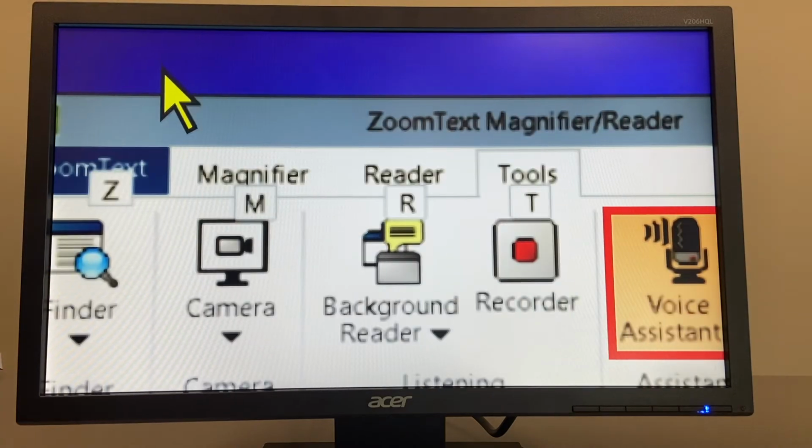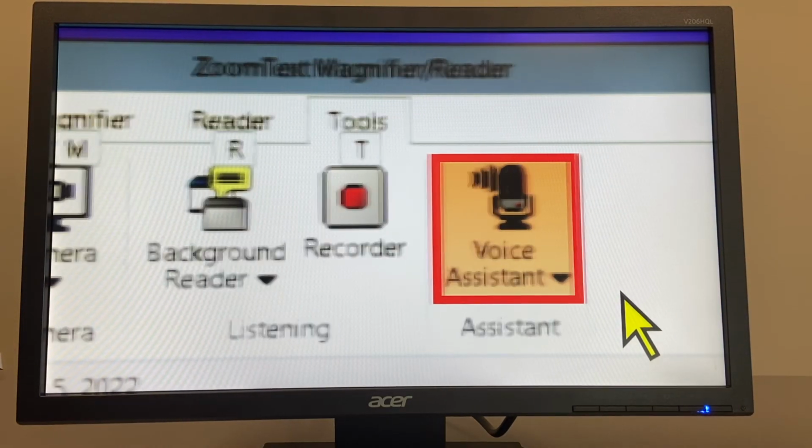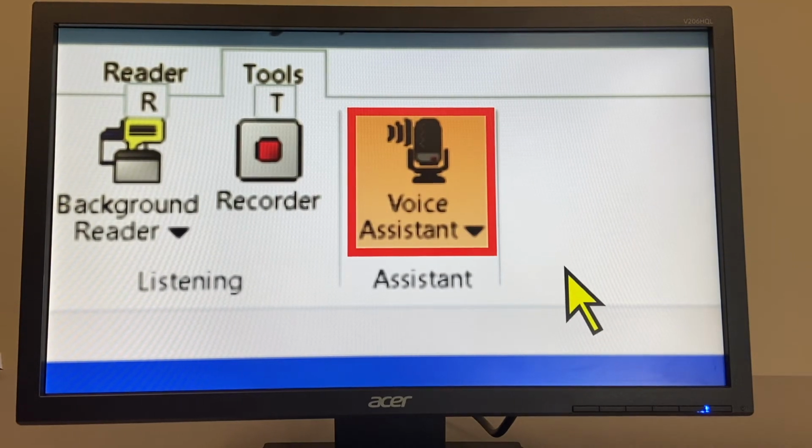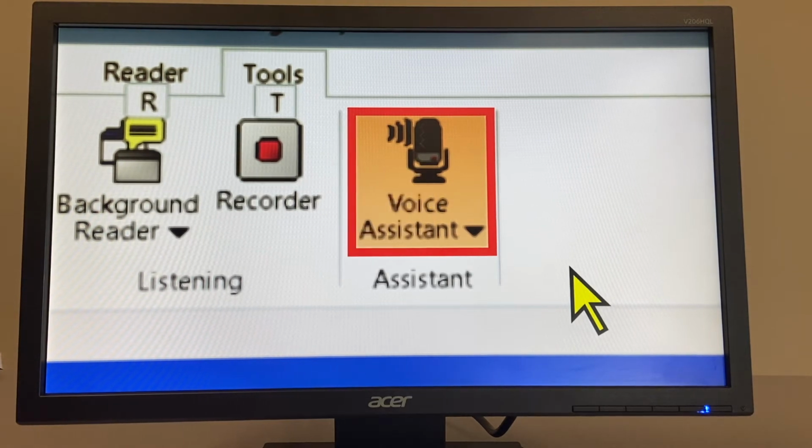So it's your virtual assistant, and usually it works with the wake word. It might not be set up to work yet with the wake word, but when you have it set up, you just say Zoomy, and increase magnification. Sorry, I didn't catch that. Okay, so the wake word does work right now. So when you have the wake word, you just say the word and then the command, and it will do the command that you specify.